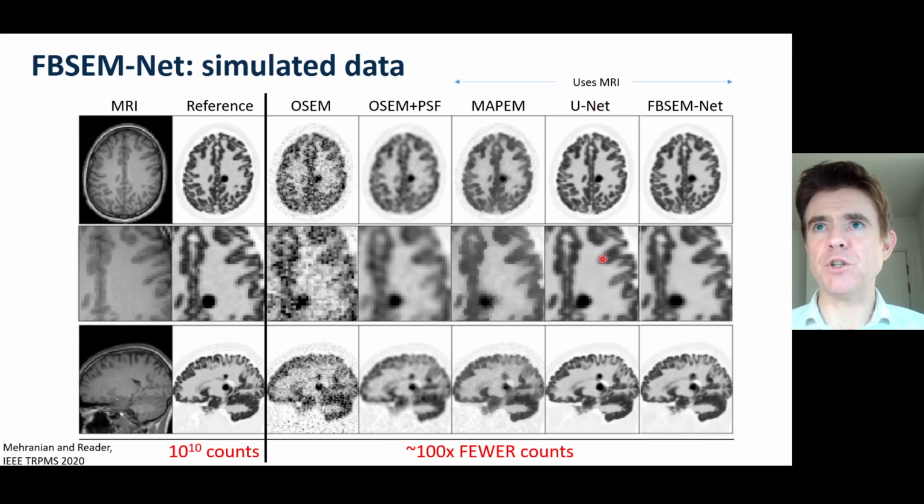Although in fact the conventional UNet, which is just a post-reconstruction CNN, a UNet applied post-reconstruction, is actually also doing very well, but this doesn't revisit the data, whereas this one does. And so it'd be interesting to look at cases of tests for generalization to show that this one can benefit from revisiting the sinogram data at every single iterative update.